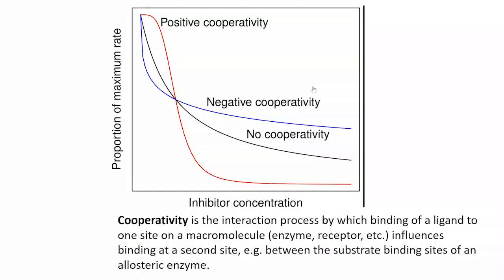I think we have to take into account that antibodies, as we know them, don't behave as perfect binding situations. They go from a high affinity situation of 10 to the minus 11, 10 to the minus 12, 10 to the minus 13 molar, to a low affinity situation of 10 to the minus 8, 10 to the minus 9, a thousand-fold difference, simply by the fact that they're being occupied. So the more hormone you have bound to an antibody, the lower the affinity of that antibody to actually continue binding.